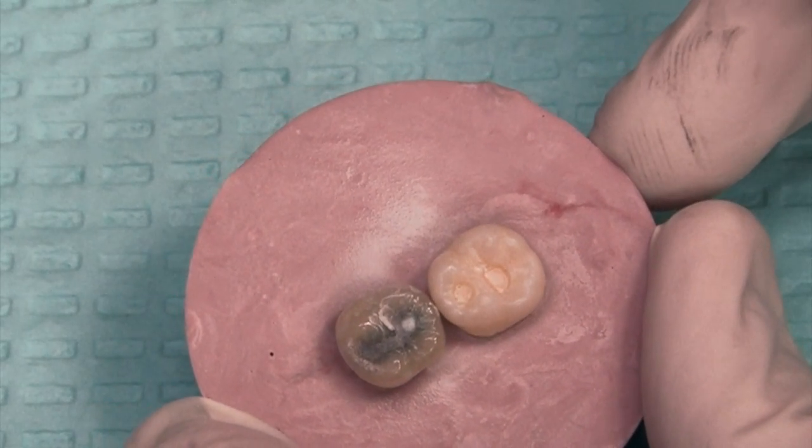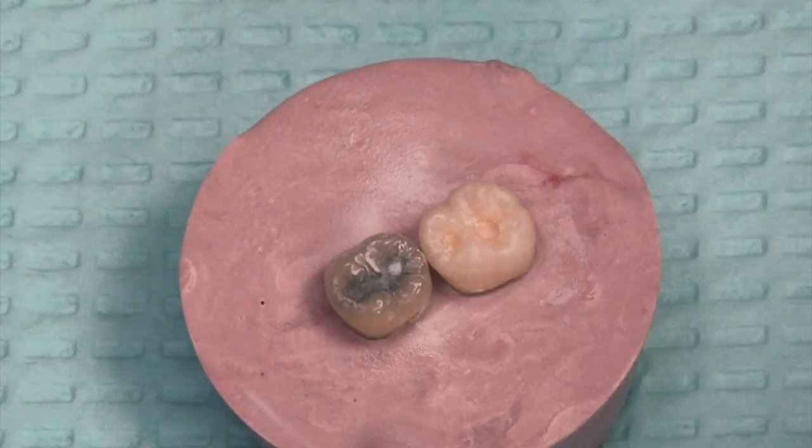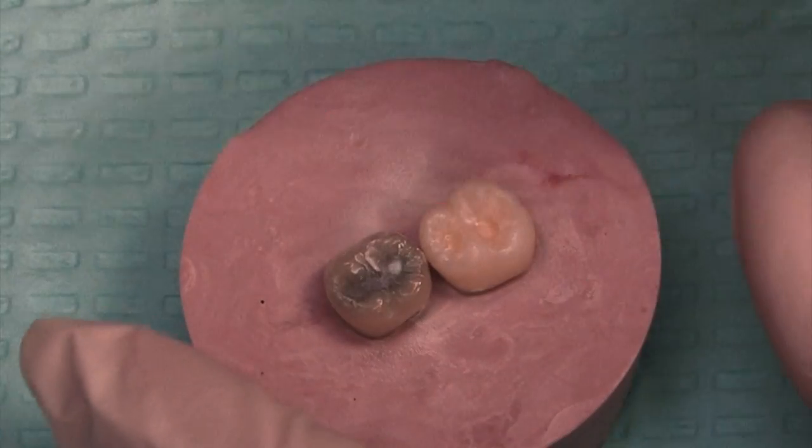Then partway through, or even when I think I'm done, I will go in with an air-water syringe and blow off the debris, and just evaluate to see if there's any remaining areas of decay or if there's any uneven or rough edges.